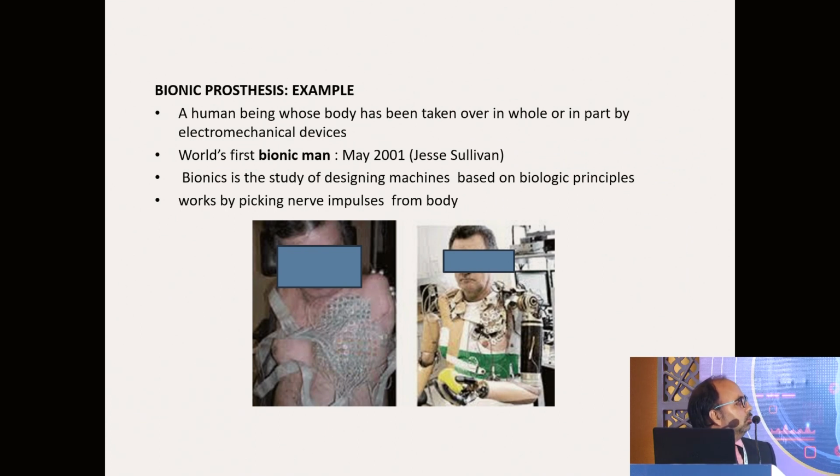Then this is a person using a bionic prosthesis. So just now I'm finishing the process, but I will come to orthosis. But just before I end, I want to just emphasize one thing about advances.